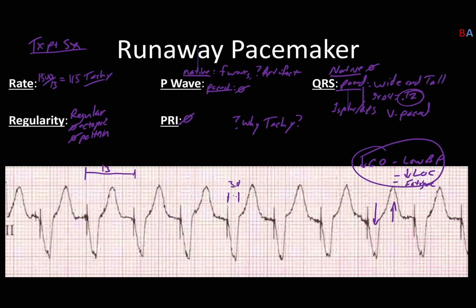Ultimately, interrogation is how you're going to figure out exactly what's going on, and that needs to be read by the cardiologist or someone else that has that level of training. That's runaway pacemakers. In short, it's all about treating the symptoms of the patient and what they have going on, that kind of stuff.